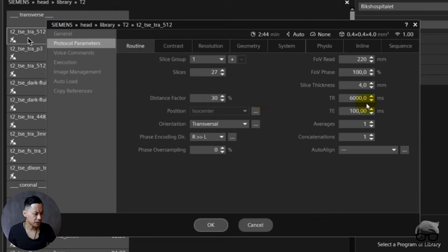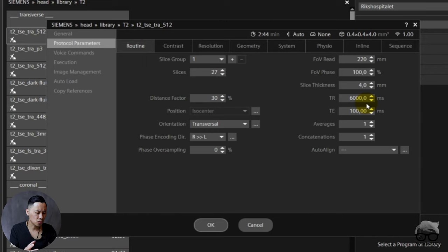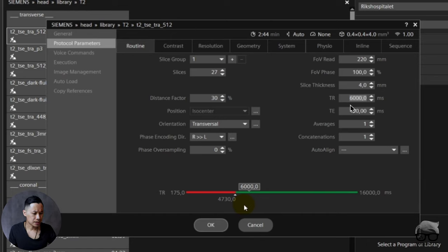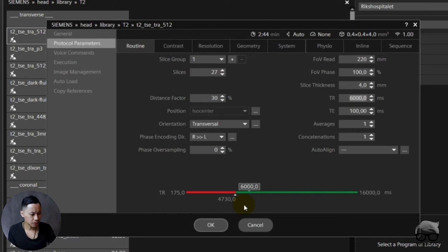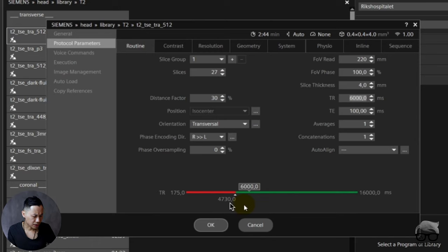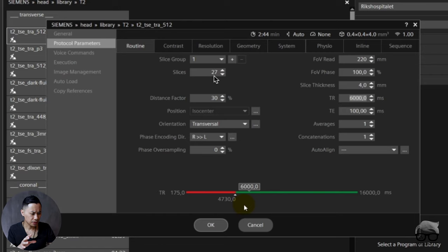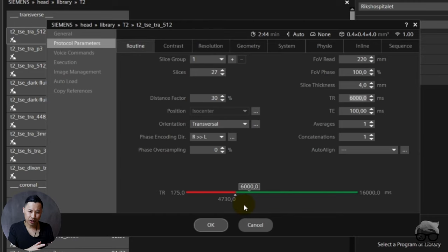Let's check this sequence from geometry. The TR is 6000 and they have one concatenation. So what does this mean? You can see here now with this TR, with how the sequence is set up optimized, you can see there's a space here, a little space here from 4730 to 6000, a little space there which means that you can also add on a little bit of slices. So with 27 slices you have a little bit room before you reach the top of the TR. So this is the practical, but let's just check a little bit for the theory.